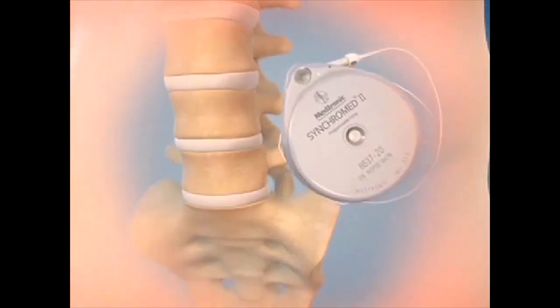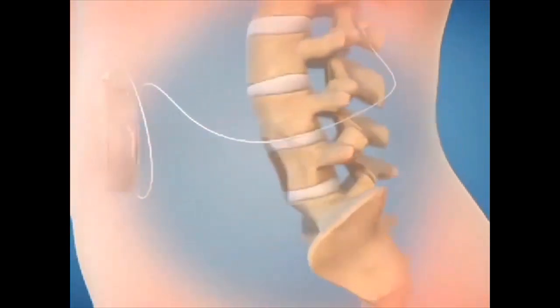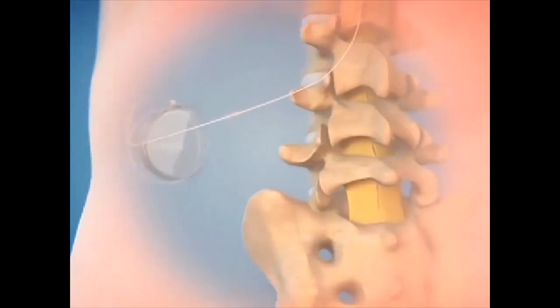The position of the pump pocket should be determined before surgery. The pump is implanted subcutaneously, usually in the lower right or left abdomen, away from the superior iliac crest and rib cage. When considering where to put the pump pocket, a couple of things need to be thought of. I tend to pick the left side first, just for the idea that if a patient ever needs a surgery on his abdomen, it's either going to be the gallbladder or the appendix, which are on the patient's right side.